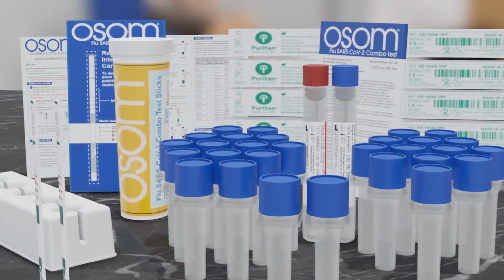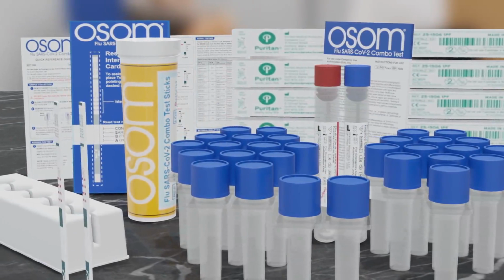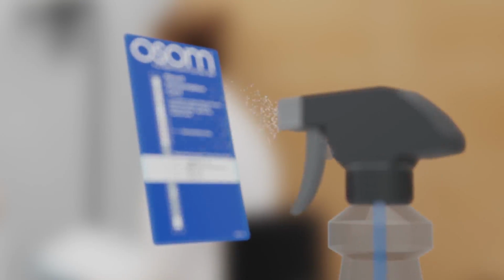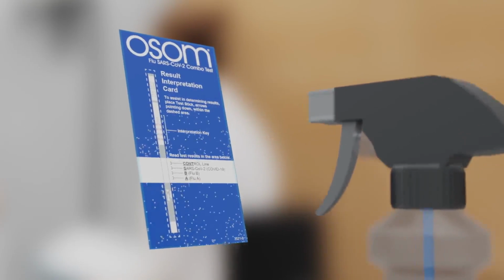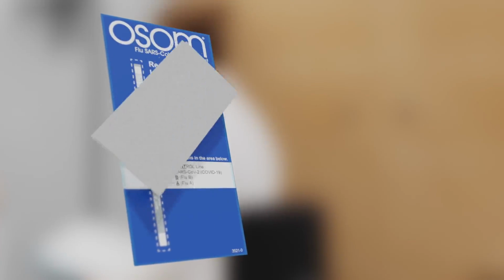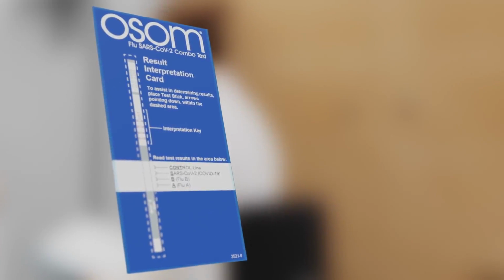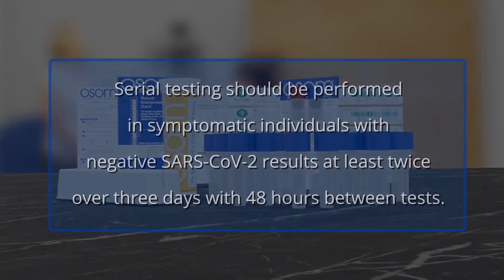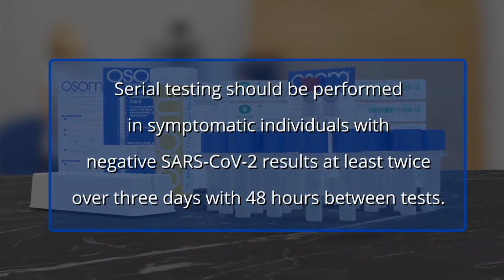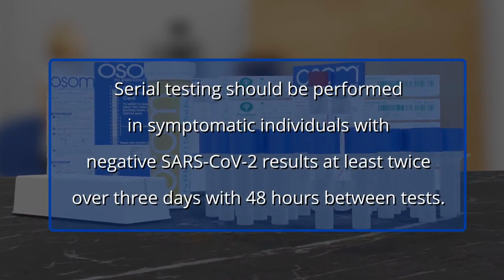Inadequate or inappropriate sample collection, storage, and transport may yield false test results. The result interpretation card should be cleaned after each use by spraying the laminated card with 70% ethanol alcohol, or alternately by wiping with a clean towel moistened with 70% ethanol alcohol. The result interpretation card should be wiped dry with a clean towel. Serial testing should be performed in symptomatic individuals with negative SARS-CoV-2 results at least twice over 3 days, with 48 hours between tests. Good sample collection and sample handling are the most important first steps for an accurate test result.